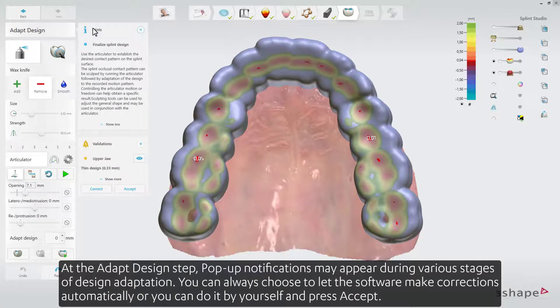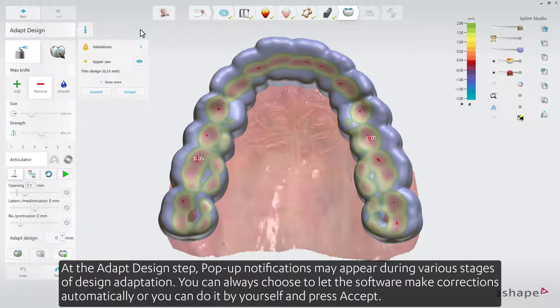At the Adapt Design step, pop-up notifications may appear during various stages of design adaptation. You can always choose to let the software make corrections automatically, or you can do it yourself and press Accept.